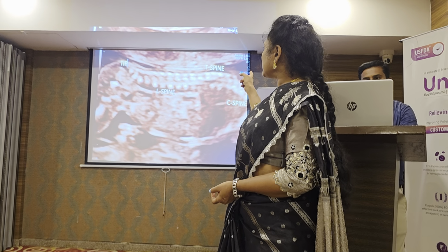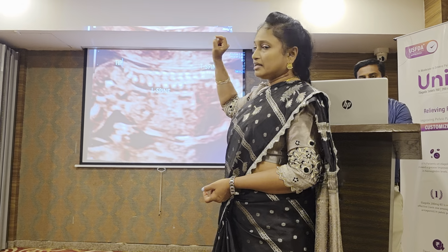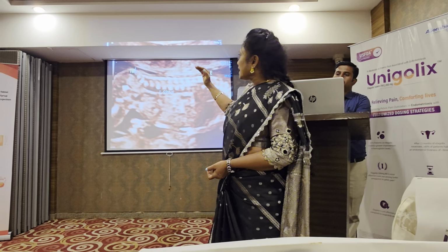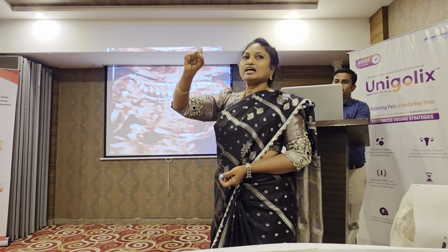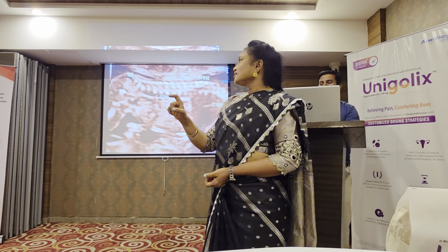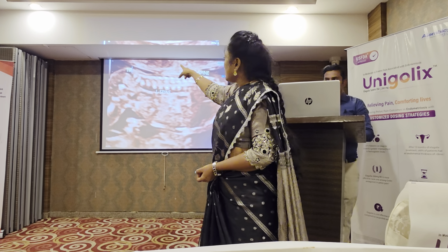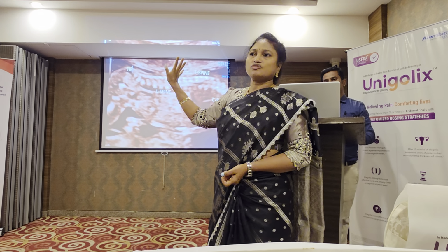Cervical spine, thoracic and lumbar, and the end where the coccyx ends, there should be a slight up tilt. That up tilt tells you that the entire lower portion of the spine is normal, because that is where most of the spina bifida occulta, meningocele, sacral agenesis, all these happen at that last minute. So look for that tip. If there is an up tilt, it means everything is fine.